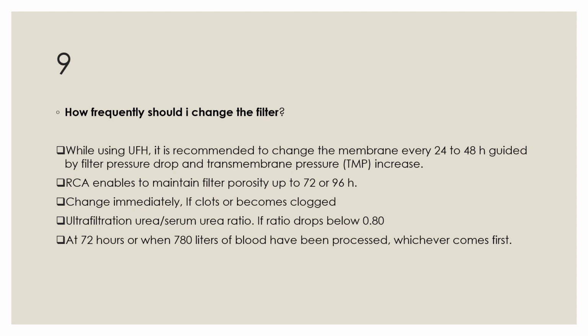How frequently should I change the filter? While using unfractionated heparin, it is recommended to change the filter every 24 to 48 hours, guided by filter pressure drop and transmembrane pressure increase. Regional citrate anticoagulation enables to maintain filter porosity up to 72 to 96 hours. If the filter clots or becomes clogged, it should be changed immediately irrespective of duration between change.